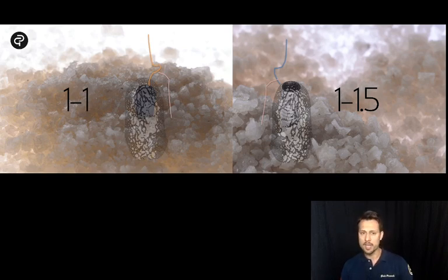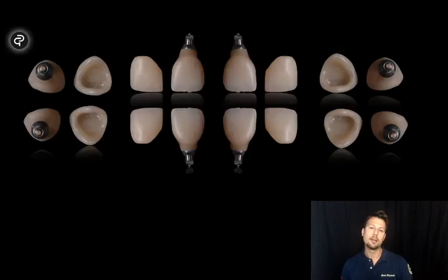So it's closer to the natural tooth and we have much more tissue around the conical connection. The tissue is what we need for the long-term result and for the height of the papilla, if we talk about aesthetics. And with the root membrane technique, that gives us data that are closer to the natural tooth than to the implant, because we save all the periodontal structure, that is the structure of a tooth and not the structure of an implant.